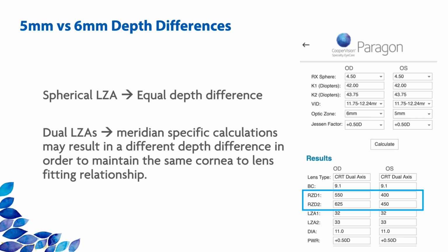This is only relevant when I see a decentration post ortho-K fitting, and I want to tell whether this is truly a decentration that I need to fix, or most likely a pseudo-temporal decentration because of the uncorrected angle kappa. So to answer this question, no, you don't need to have an angle kappa corrected baseline topo.